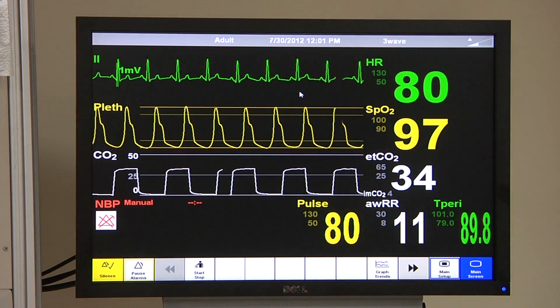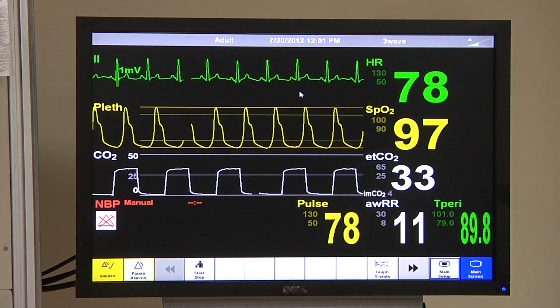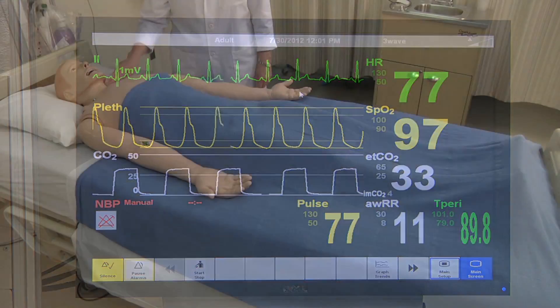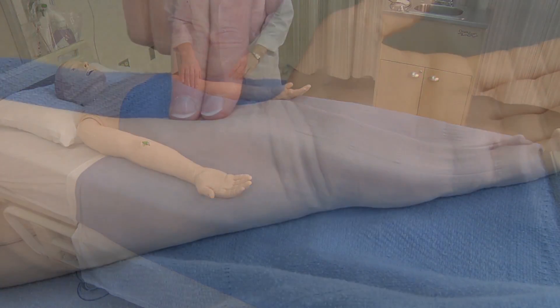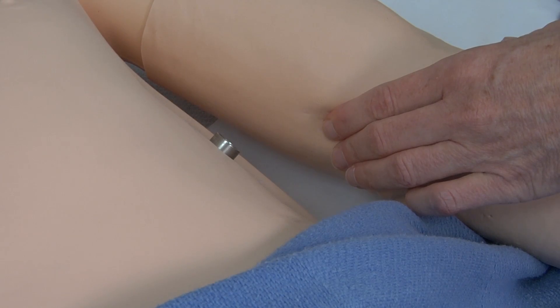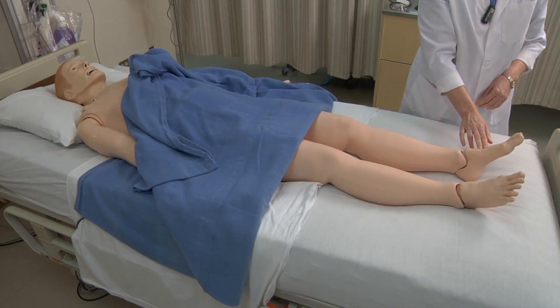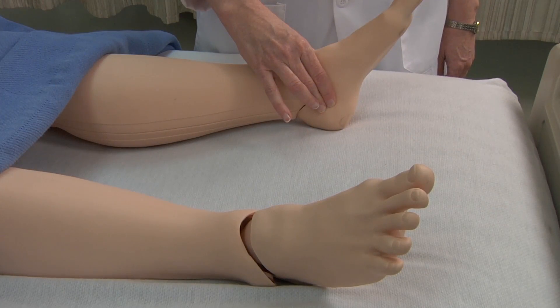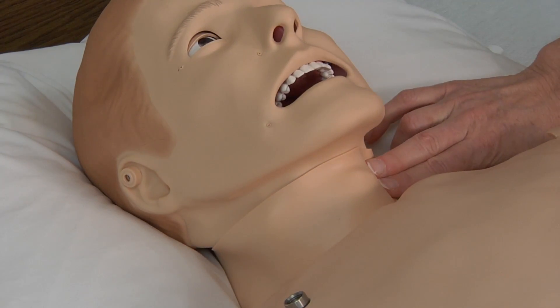SimMan has a remarkable set of features that include central and peripheral pulses. These include radial pulses, brachial, femoral, pedal, posterior tibial, and carotid pulses.